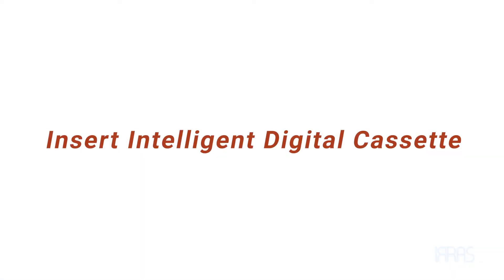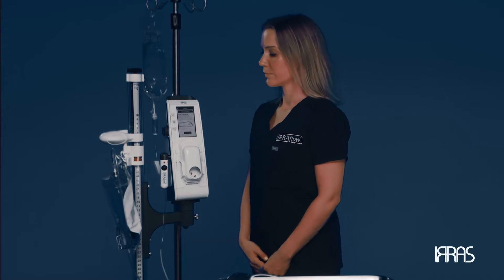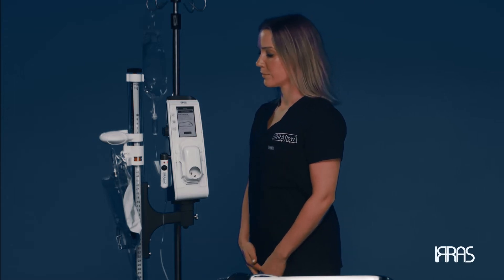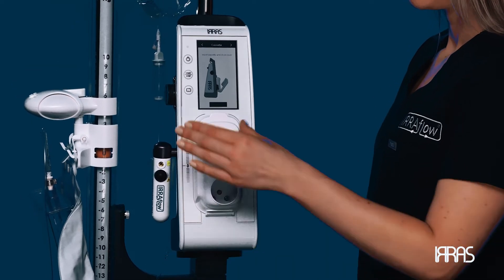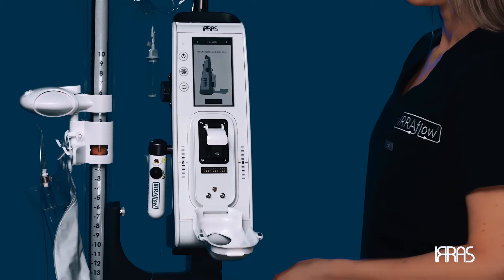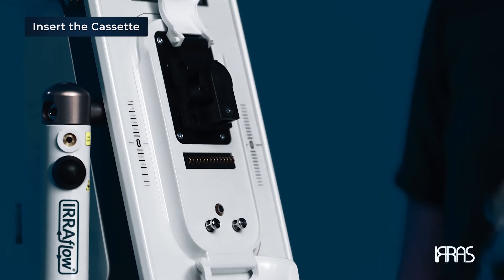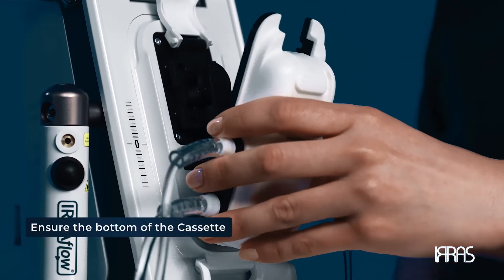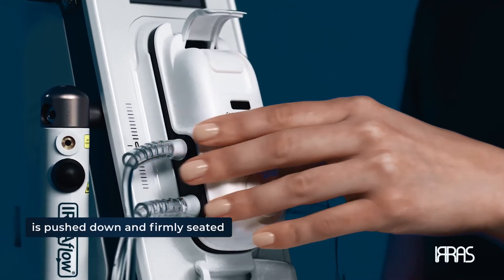Insert the intelligent digital cassette. Now that we have this completed, we are ready to attach the intelligent digital cassette onto the IRRAflow control unit. To start, open the cassette door. The control unit will prompt you to attach the cassette, close the cassette lever, and then close the cassette door. First insert the cassette by inserting the bottom and then the top. Ensure the cassette is pushed down and firmly seated.